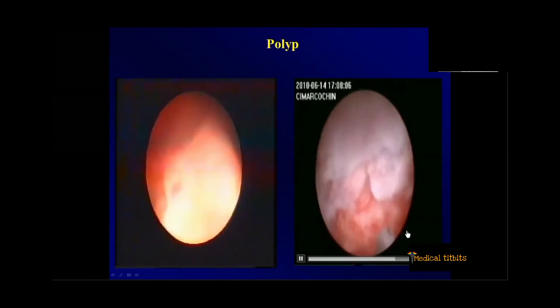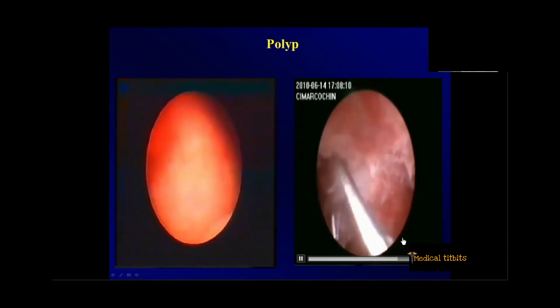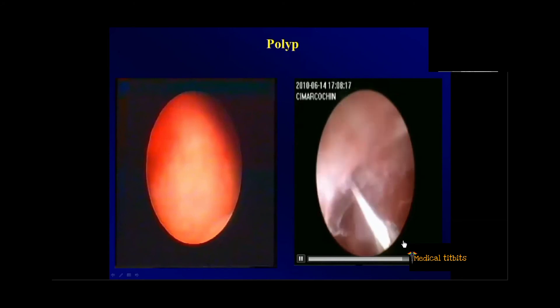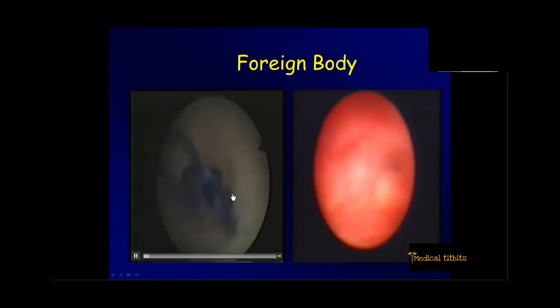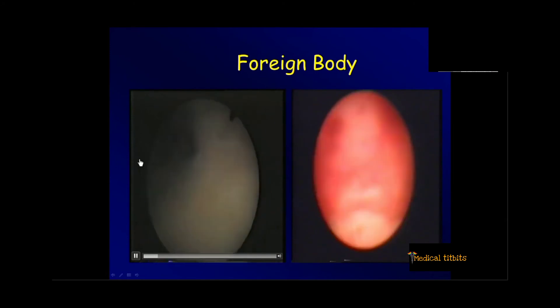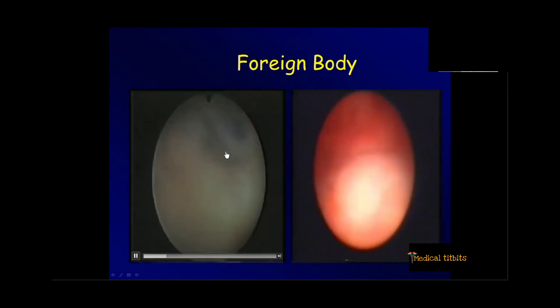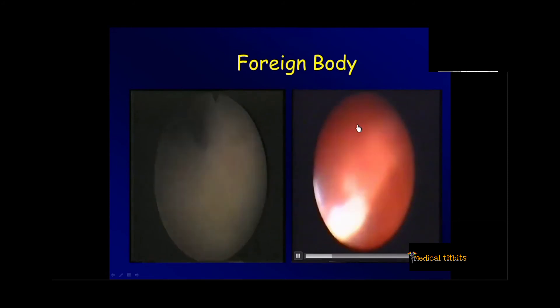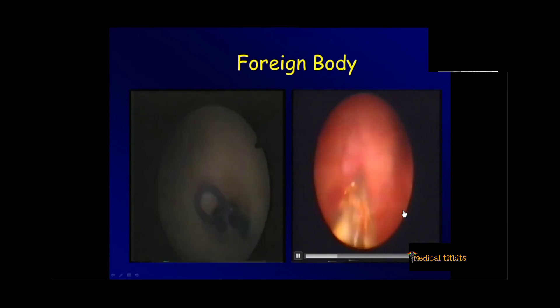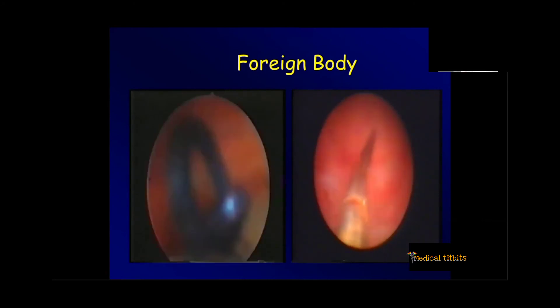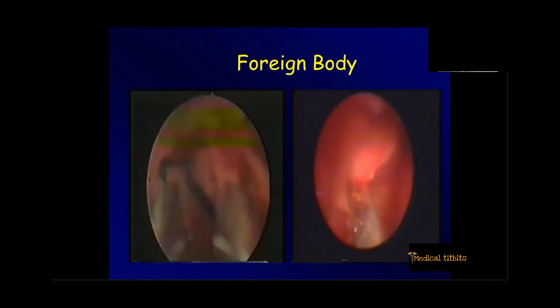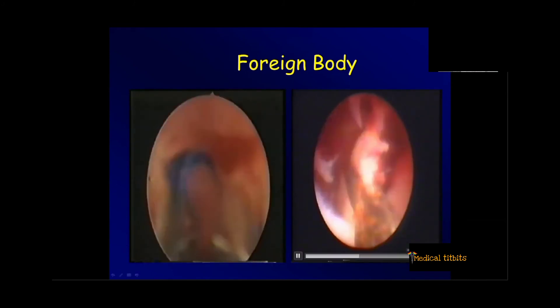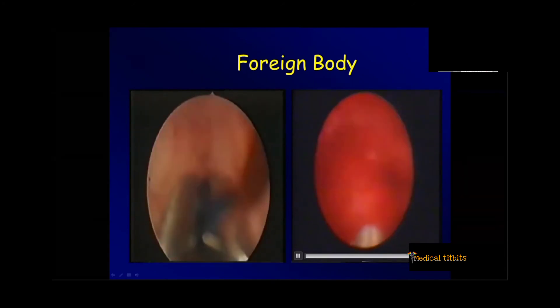This can be done even with a smaller scope less than 4 mm. If you see any lesion, just introduce the instrument through the channel. Even a septum — just change to glycine and use the monopolar electrode. If you see a foreign body, this patient came for IVF and the endometrium appeared thin; there was a cornual area implant-like insert. This is a picture of a bone fragment inside the uterine cavity post-abortion — big bone pieces. When you see bone pieces, you must not curette, because if it is an older bone piece it will become embedded into the endometrium. You have to distend and take it out with a grasper.